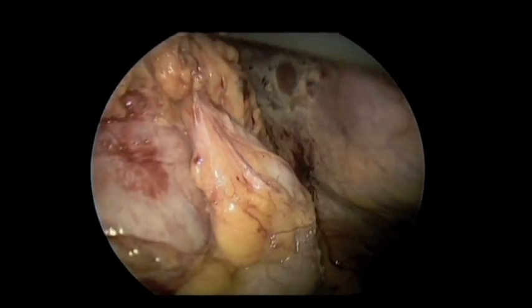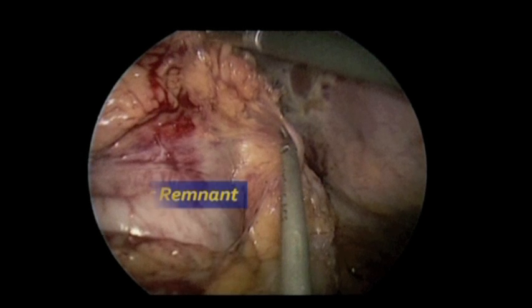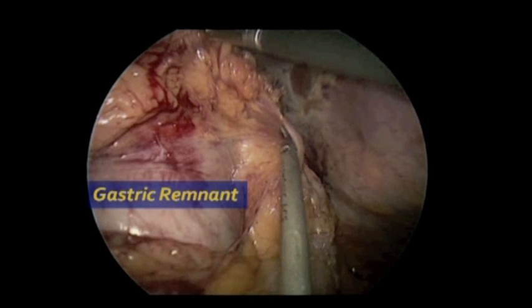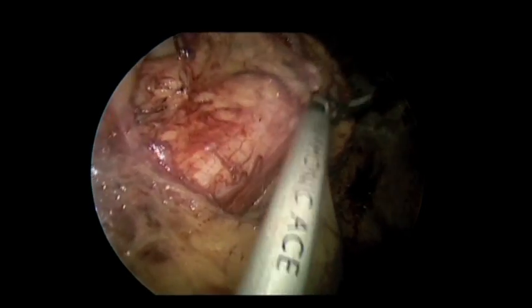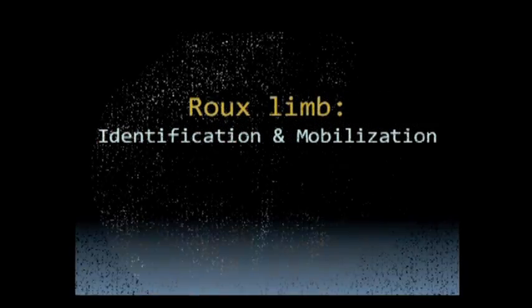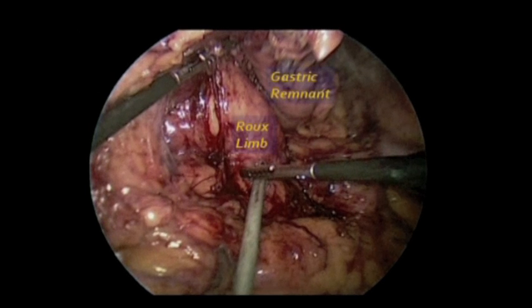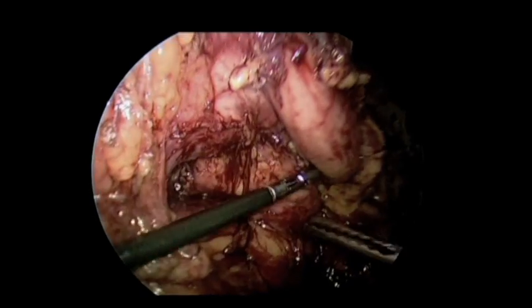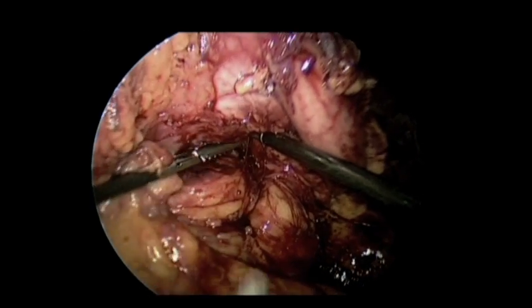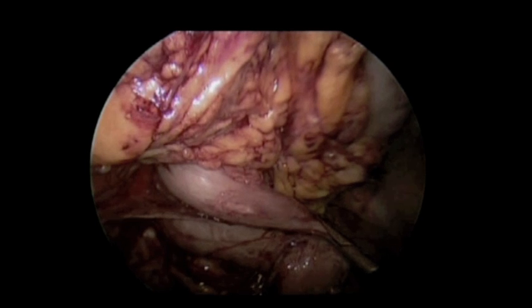Considering the oncologic principles of the surgery, we kept all the mesentery as much as possible with the gastric remnant. Once this mobilization was completed, the posterior aspect of the remnant was visualized and the Roux limb was identified, which was originally brought up in a retrogastric, retrocolic fashion. We tried to define the Roux limb a little bit better here — it's not easy when the original surgery was open with a lot of adhesions.